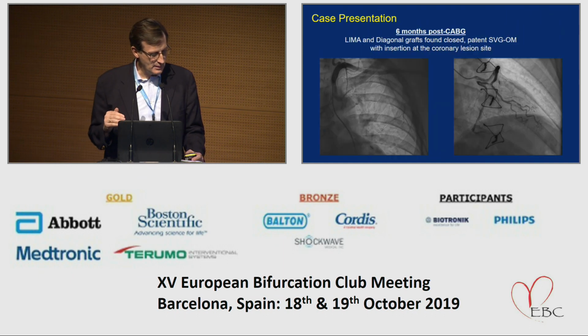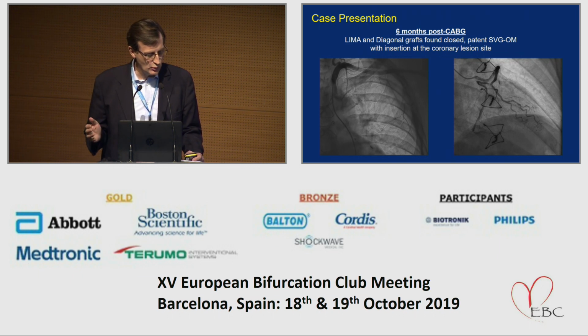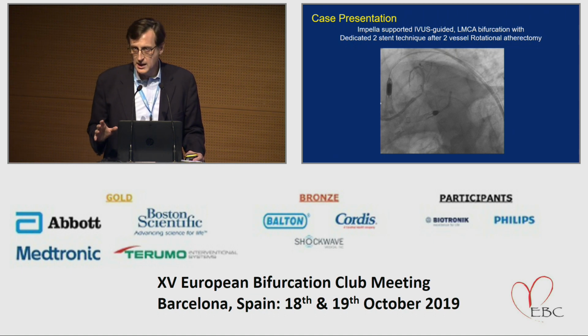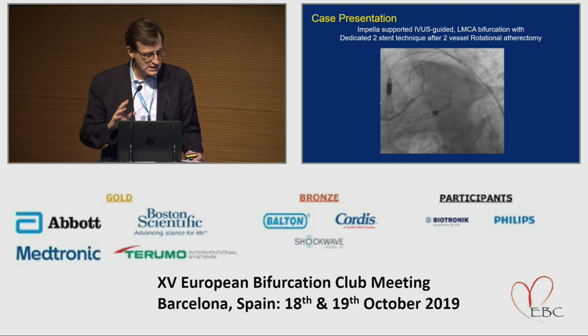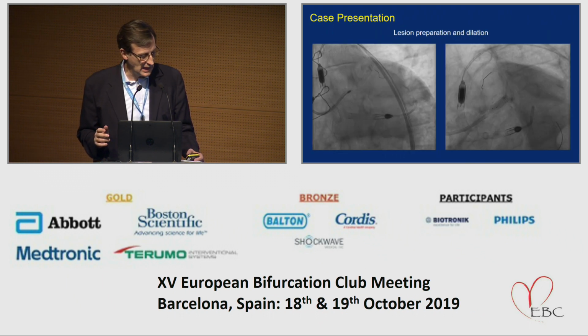A few months after the bypass, the patient was referred back due to recurrent symptoms, and a nuclear stress test indicated that 2 of the 3 grafts were completely closed and some modest compromise of the last graft. So in that situation, we went to a very highly calcific lesion involving both vessels, and chose to do quite a bit of rotational atherectomy down both vessels. For this reason, chose to have hemodynamic support during the case.